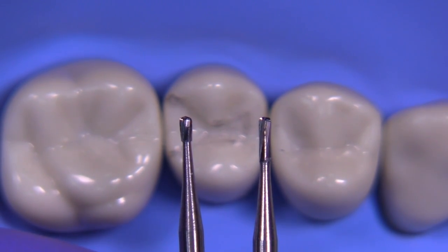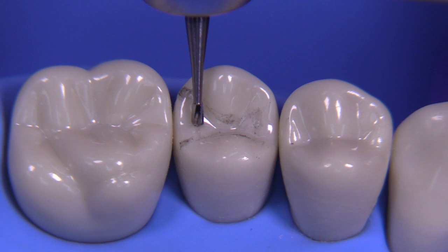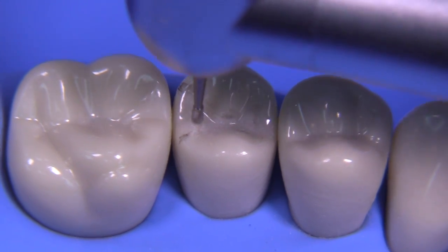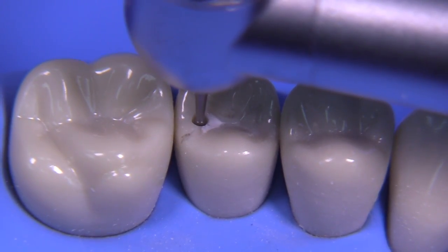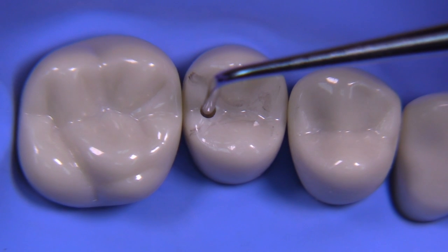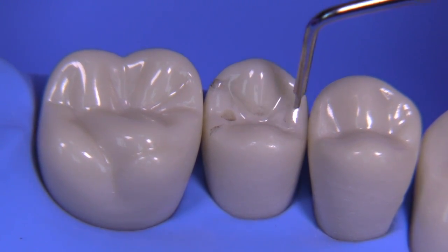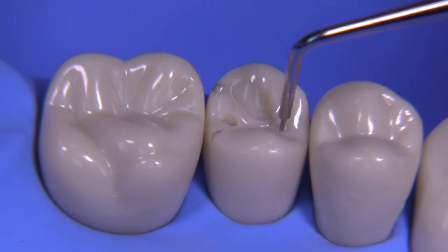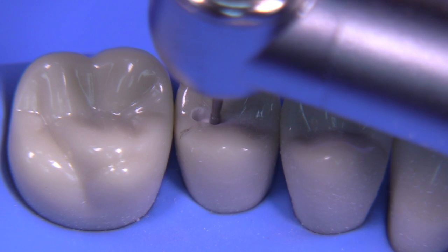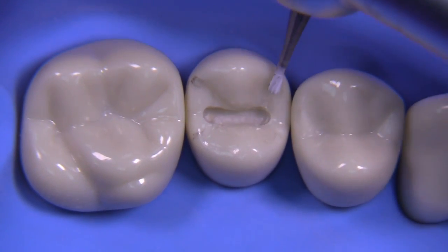Let's start with the 330. The best place to start on any class II is in the area near the box, because if you start in the mesial pit area you can overextend into the dovetail. So we're just going to make a punch cut here to the full depth of the flutes of the burr. We're not going to go shallow, because if you go shallow you end up getting wider and wider as you go deeper. I'm going to verify that I am 1.5 millimeters and extend over to this mesial, stopping short of our intended location. Then we'll start in that initial punch cut and move the burr right down the middle of the central groove between the cusps to obtain this initial outline.